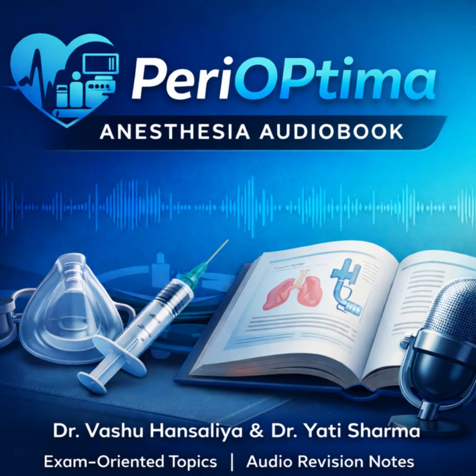Let's just summarize that whole scenario then. How exactly do these systems behave during a massive oxygen pressure loss event? Let's say the pipeline fails. The process is immediate and automatic. As that O2 pressure drops below 30 psi, the pressure regulator's output drops. The bellows or diaphragm in the failure protection device senses this, and the alarm goes off instantly, usually with a very loud, sustained sound that overrides everything else. At the same moment, the N2O flow is mechanically interrupted.